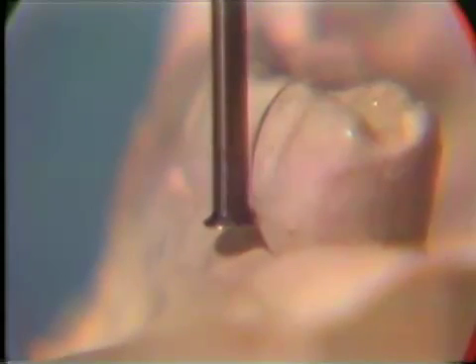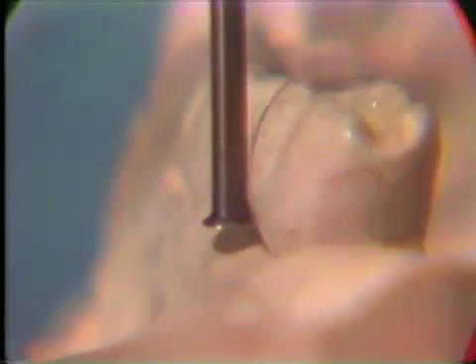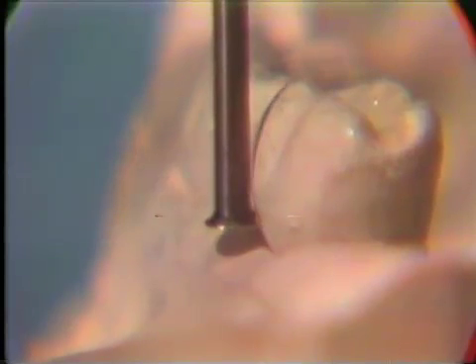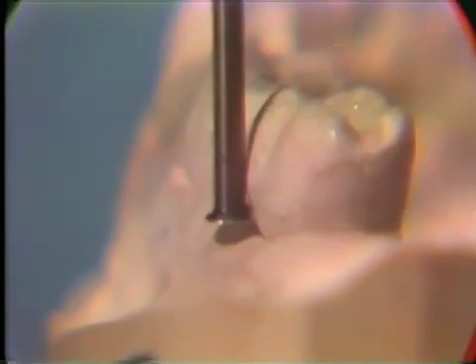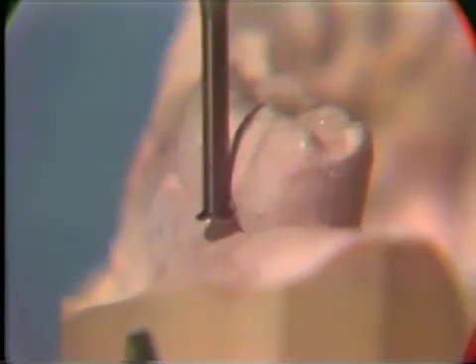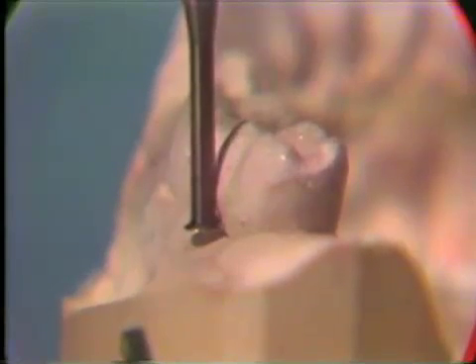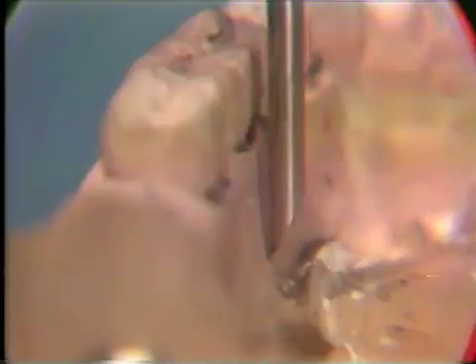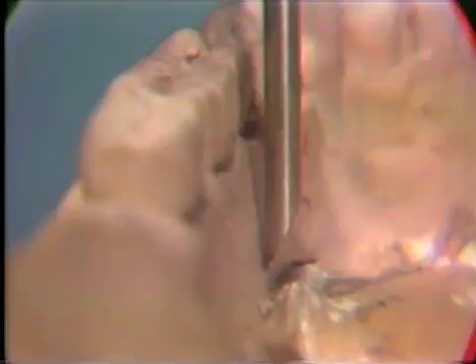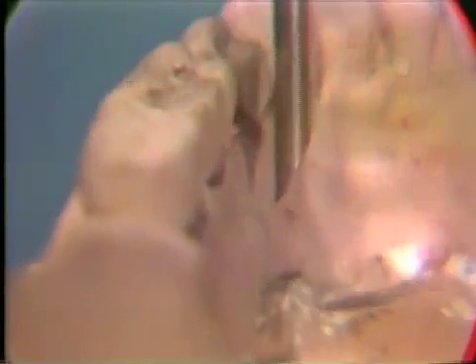A cast circumferential clasp will be utilized on the molar, and you must ensure that 20 thousandths of an inch of retentive undercut is available at the mesial buccal of that tooth. The cast should be tilted, always making sure the lingual guide plane is parallel, until you have obtained the 20 thousandths of an inch of retentive undercut. Then, all tooth and tissue undercuts around the arch must be examined and either eliminated or minimized as much as possible by tilting without losing either the guide plane or the retentive area.